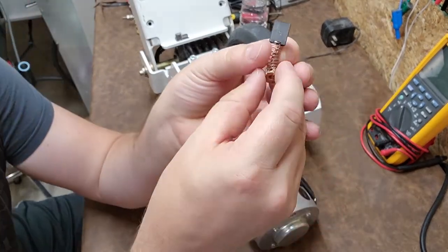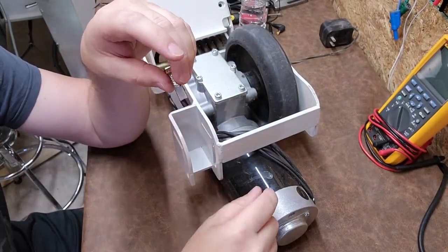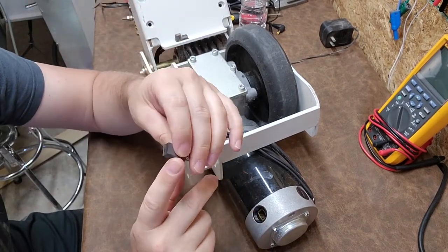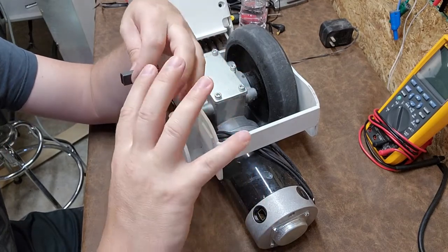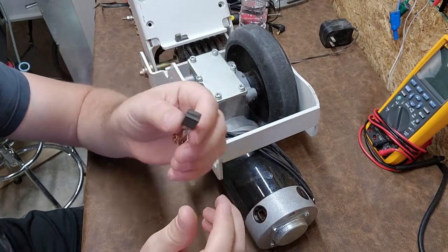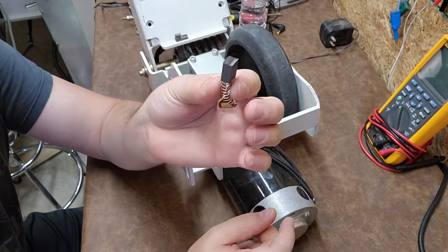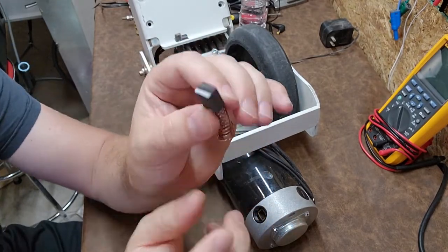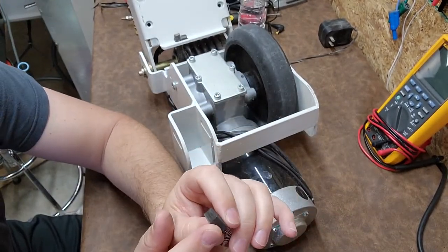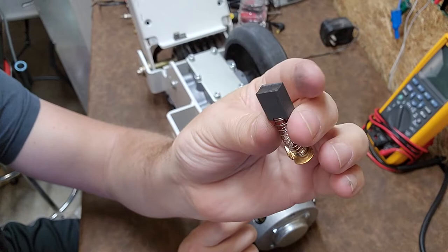Here is a carbon brush. Carbon brushes are basically what transmit electricity to the rotor - the piece that rotates - and it does this through a commutator. The rotor rotates and there are little brass bars. These brushes can tell you a lot about what's going on inside your motor. What I look at is the profile - the burn profile and the wear patterns are going to tell you a lot about the brush and about the rotor itself.